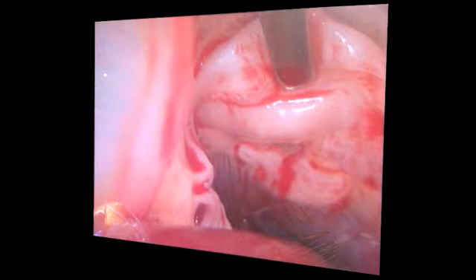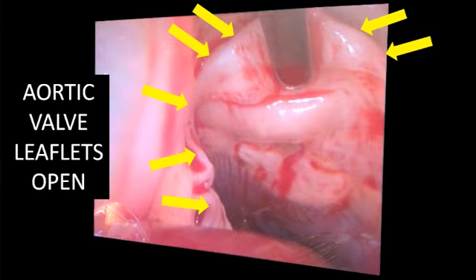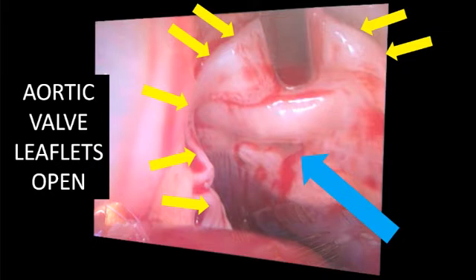Once the aorta was open and the aortic valve leaflets were retracted, the defect could be seen in the left ventricular outflow tract. The yellow arrows demonstrate the tips of the aortic valve leaflets, and the blue arrow demonstrates the ventricular septal defect in the left ventricular outflow tract.